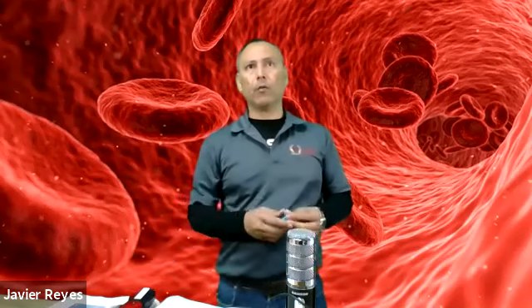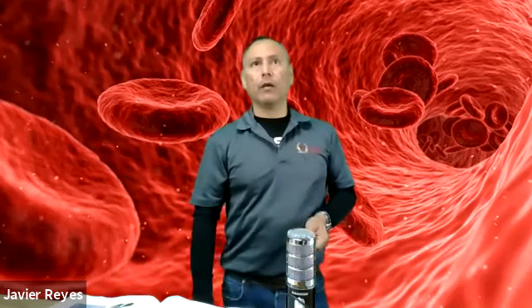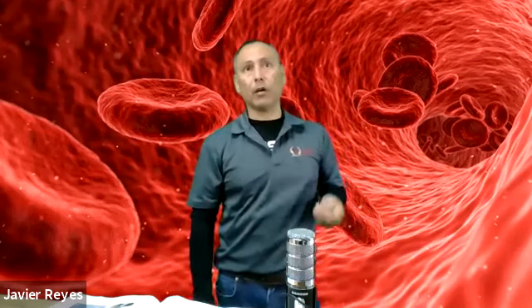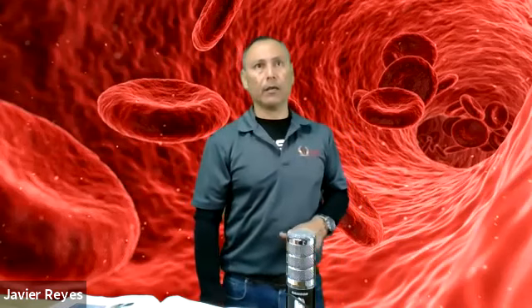Step 11, wipe away the first drop of blood, which we said is typically contaminated with a lot of excess fluid. Fill and mix tubes and containers in the order of draw. We said BEOS: blood gases, EDTA samples, other additives, and then finally your serum tubes. Collect slides first. If you're going to collect a blood smear, it has to be collected first. Collect other anticoagulants next and serum specimens last.